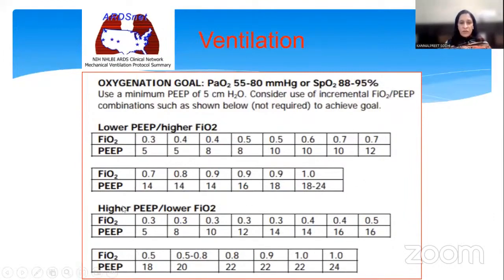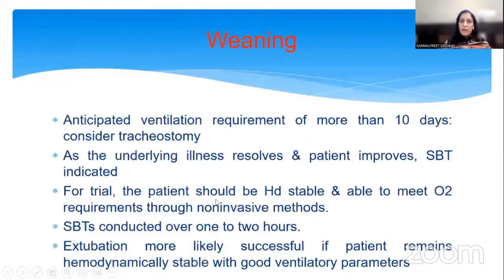It also sometimes uses higher PEEP and lower FiO2s. At lower FiO2s only, it starts increasing the PEEP. Anyway, this table is the maximally used table clinically.